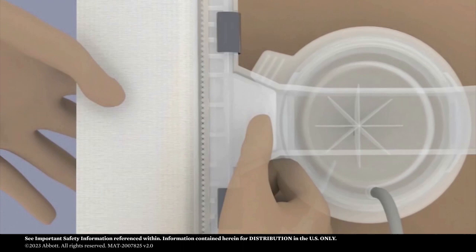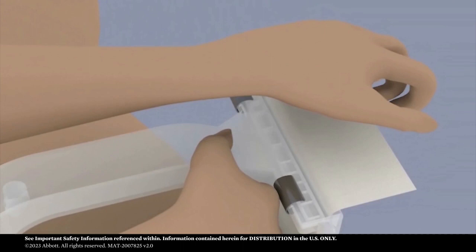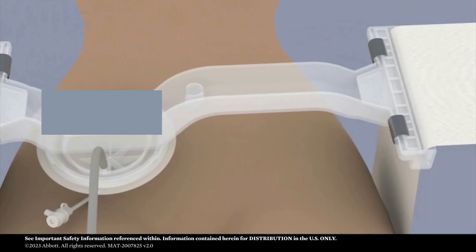Thread the belts through the locks at both sides of the FEMO Stop arch by fully compressing the levers. Adjust the belt to a snug fit. The arch should lie level and squarely across the groin area.